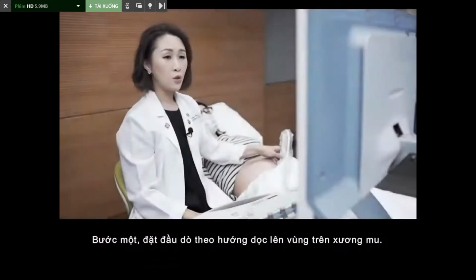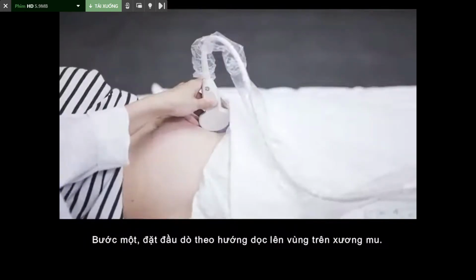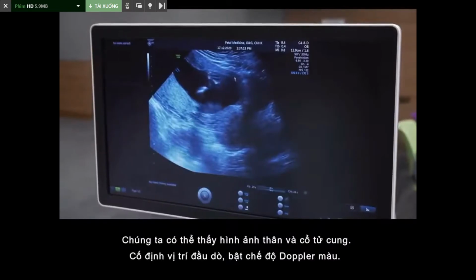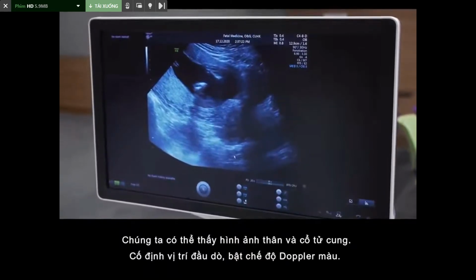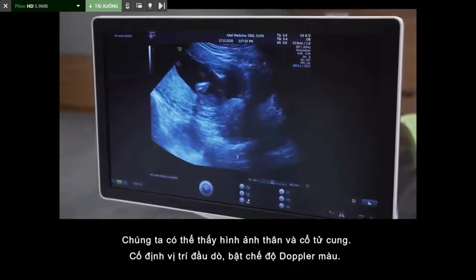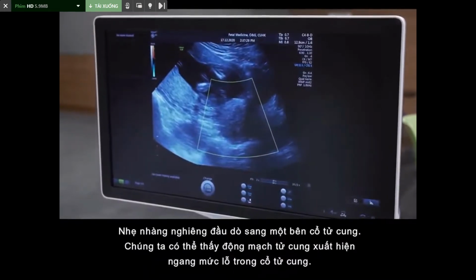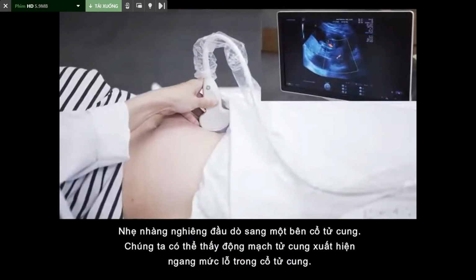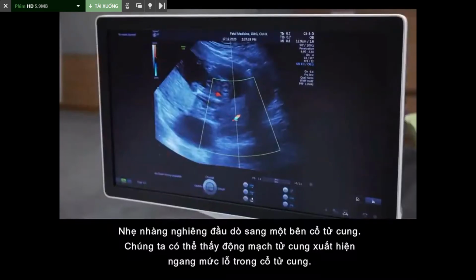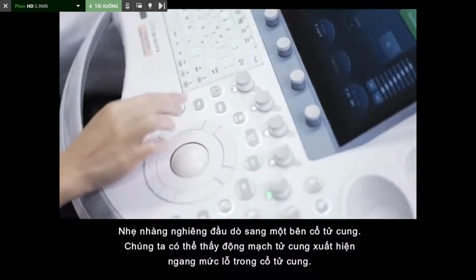So the first step is to place the probe longitudinally over the suprapubic area. You can then see the uterus and the cervix. Fixing the probe in the midline, then you can turn on color flow mapping. You gently tilt the probe to one side of the cervix. Then you'll be able to see the uterine artery appearing at the level of internal os.